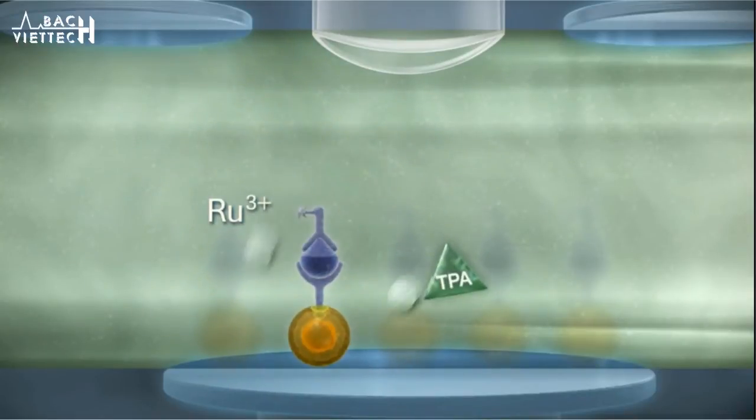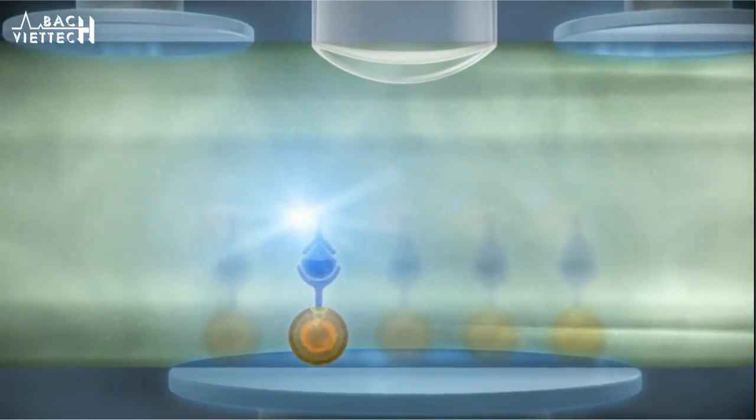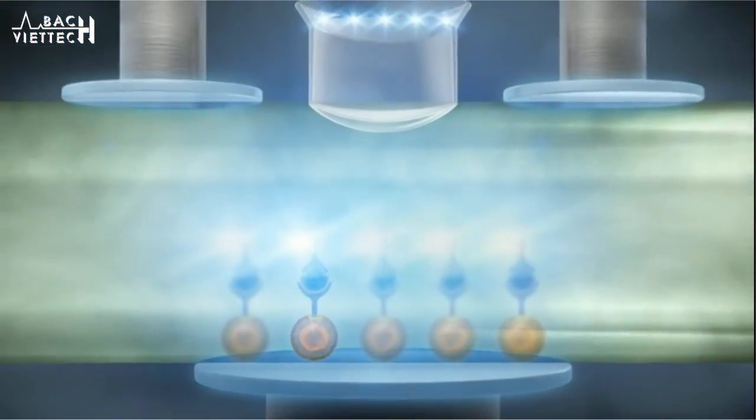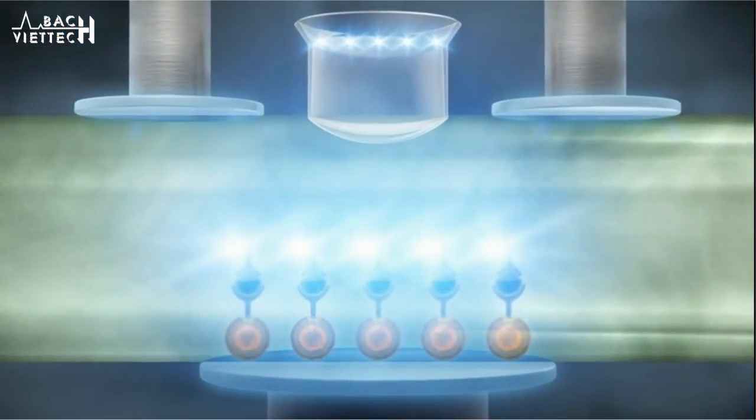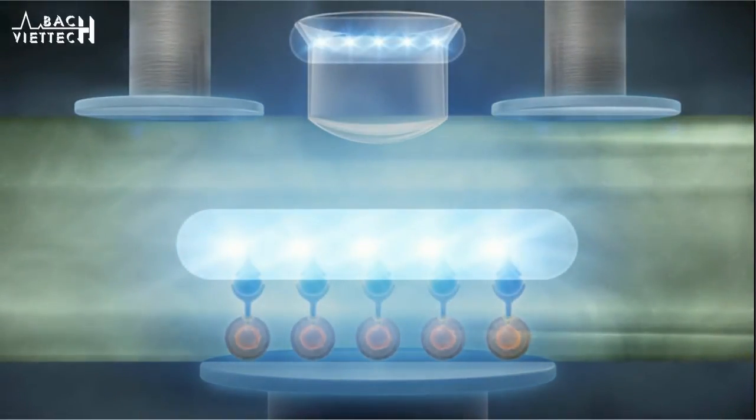The cycle of electrochemiluminescence repeats as long as voltage is applied, resulting in the amplification of the light signal. The emitted light is detected by a photomultiplier. The ECL process is complete.